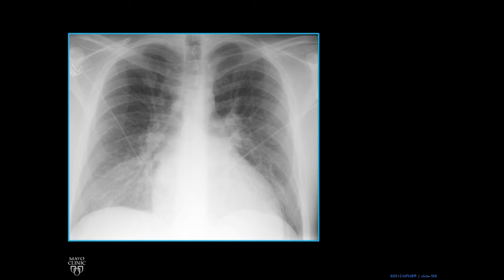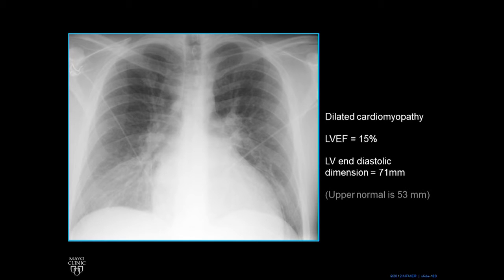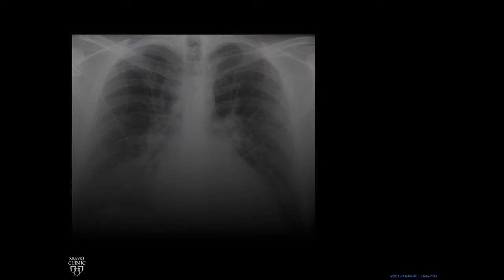You can also see how the border goes below the diaphragm, and the tip is actually way down there. This patient had a dilated cardiomyopathy, which makes the heart — the left ventricle — very big and very thin and poorly contracting. The left ventricular ejection fraction was 15%, with normal being 50% — very abnormal. The left ventricular end diastolic dimension, which is like the internal diameter of the cavity, was 71 millimeters, where the upper limit of normal is 53 — so very dilated, very poorly functioning.